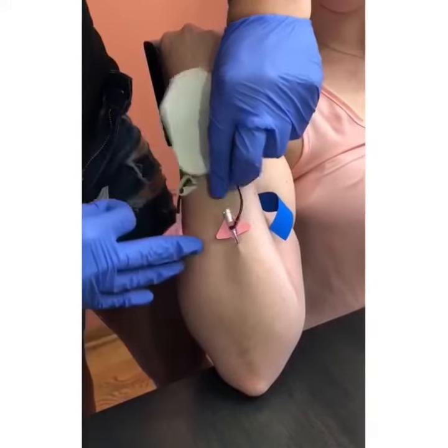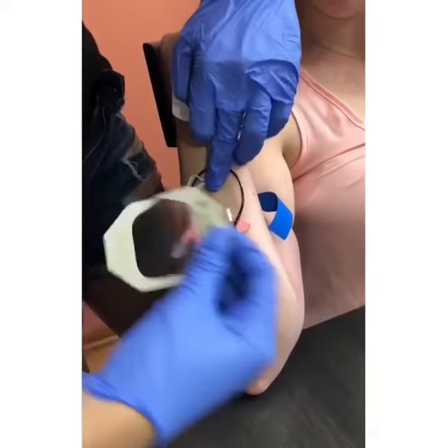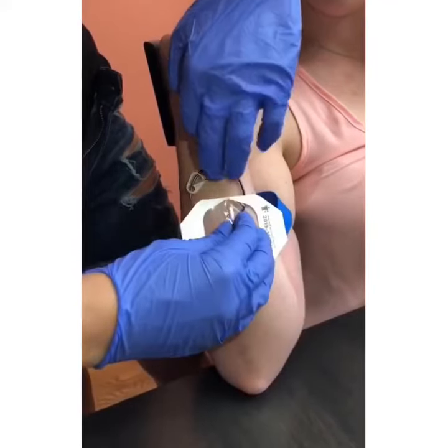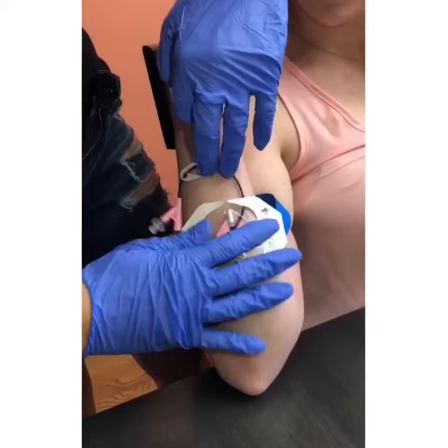I decided to slow down this video and give very specific instructions on how to do this type of insertion because I get a lot of questions about IVs in the forearms.